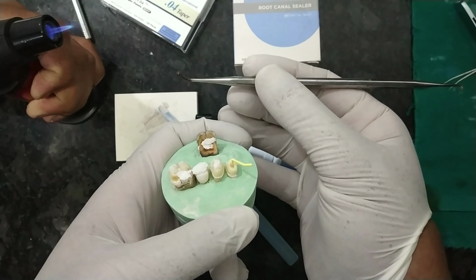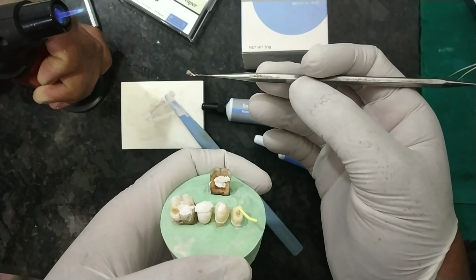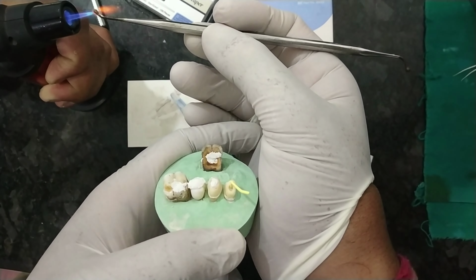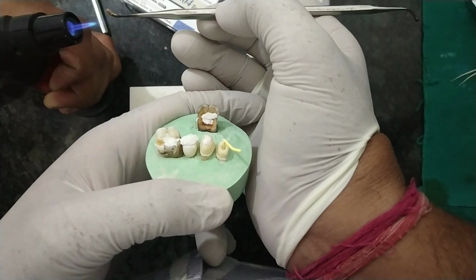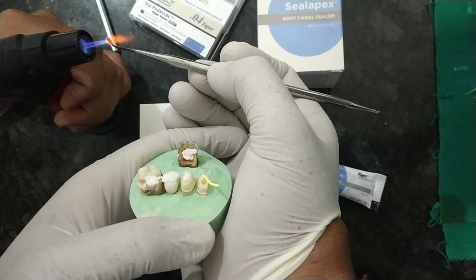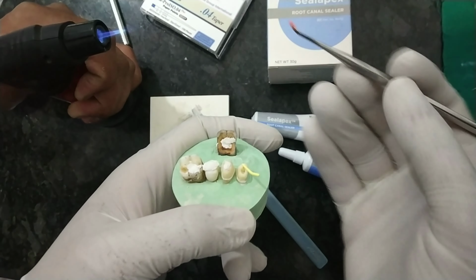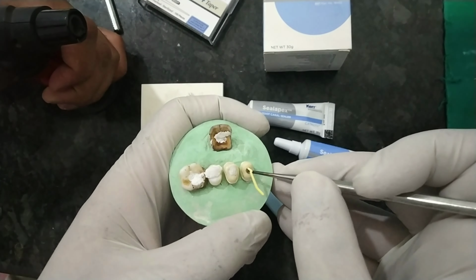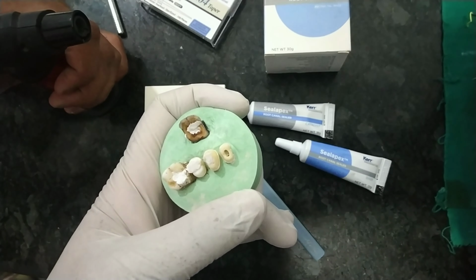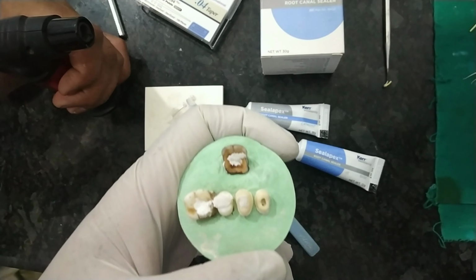so this is a ball burnisher which I am using to seal, and other instruments are also available which is like battery operated, and so I am just heating it. So you have to heat it till it is red hot. Then you just have to insert it and do like this. So your canal is sealed now. Now we'll do the other canal.